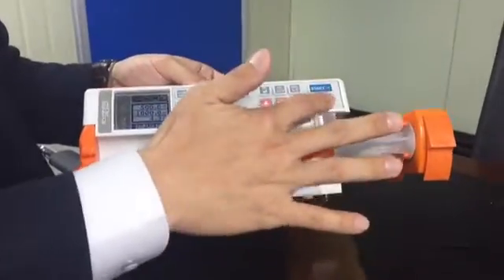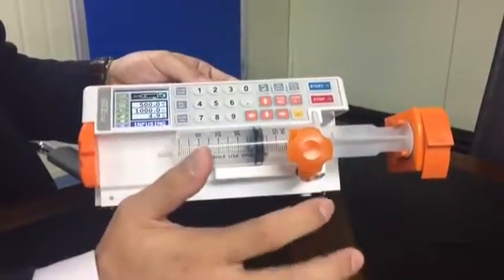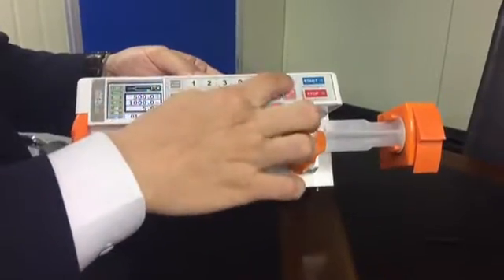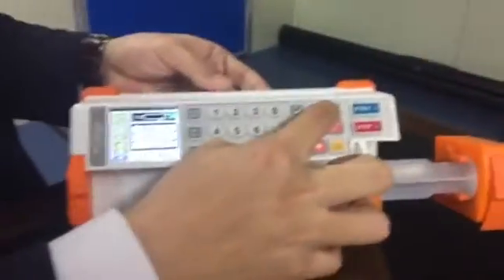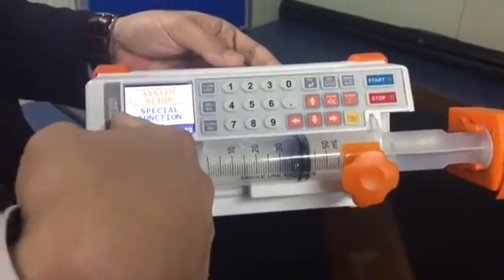There are some special functions here that users should be aware of. There is a menu button here, which gives you system setup and special function.